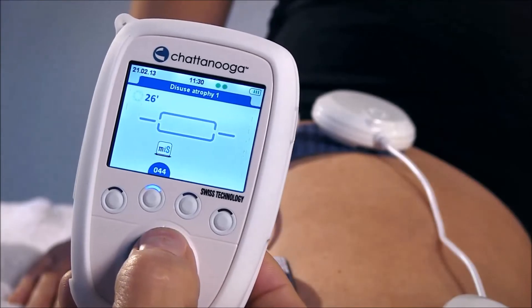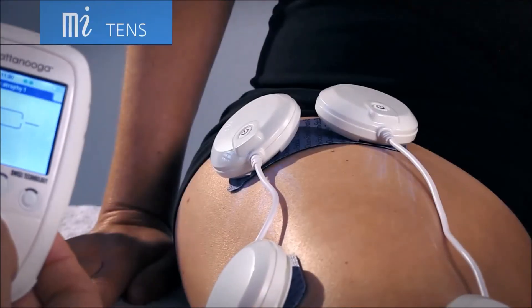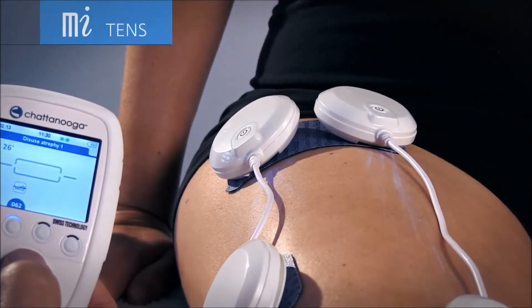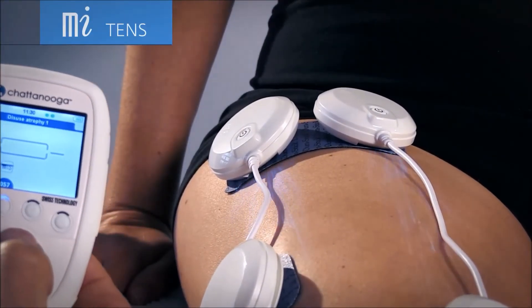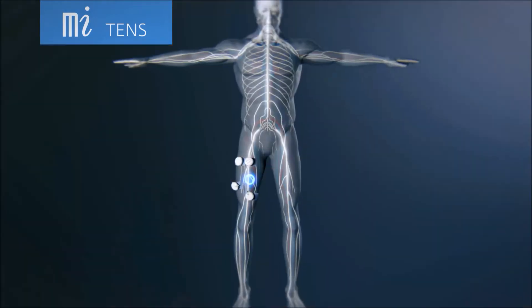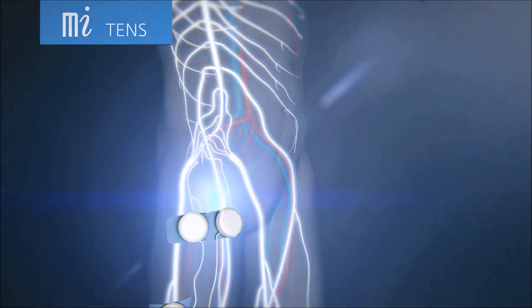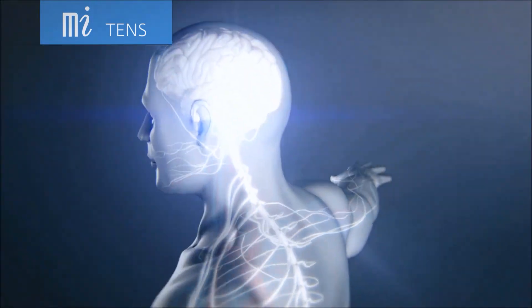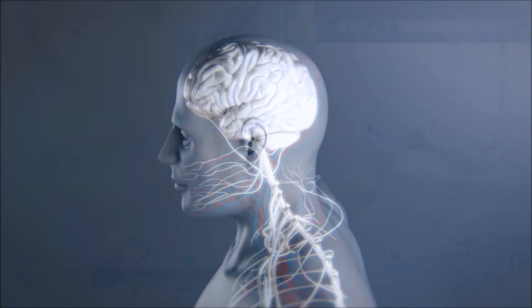MI Tense – self-regulating pain therapy. A continuous control of the stimulation intensity in order to eliminate unwanted contractions during a pain relief program.